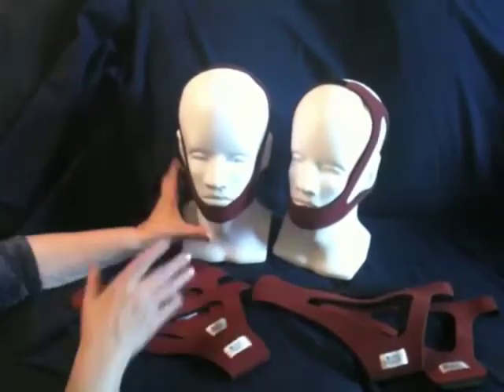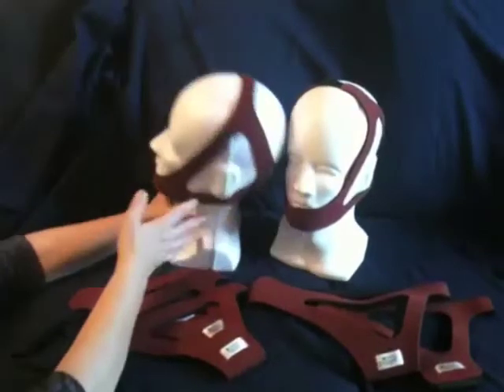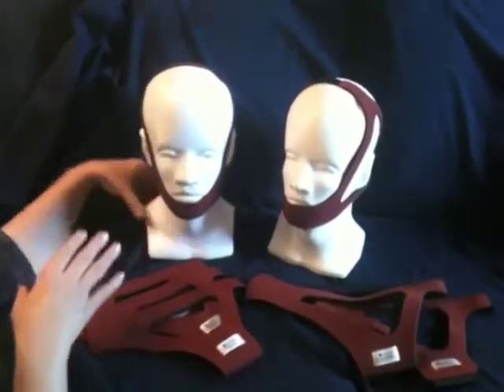It comes in small, medium, and large fixed sizes, which means there are seams and they're sewn together, so it is size-specific for a patient's head.